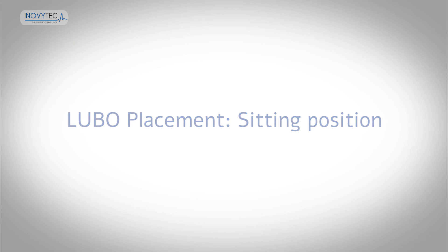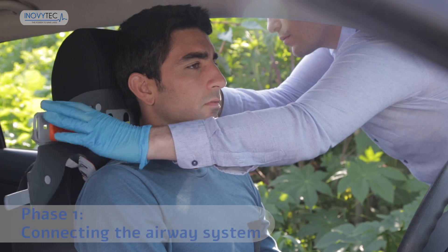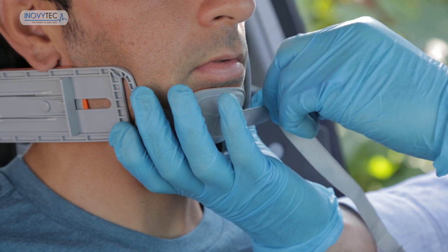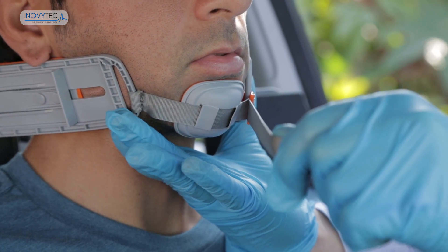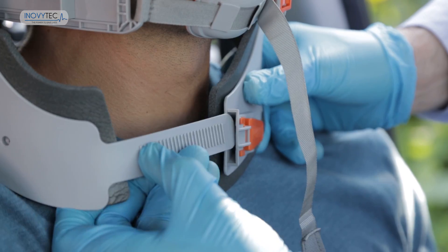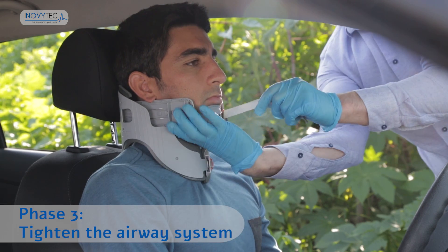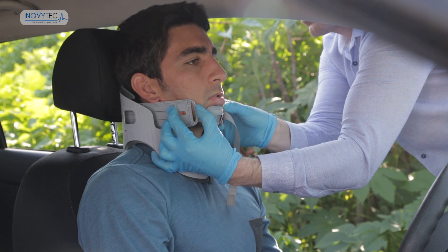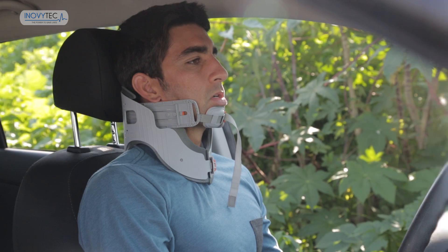Sitting position. When using the Lubo on a patient who is sitting in an upright position, make sure to hold both mandible cups with one hand while the other hand is used for attaching the hook to the left arm. Then use the ratchet system and lock the collar in place. Readjust the chin strap and pull the mandibles to the forward position to open the airway. Once the airway is secured, the patient can be transported to the hospital.